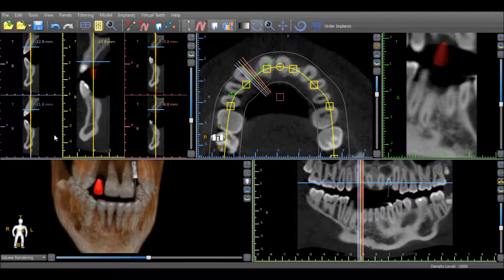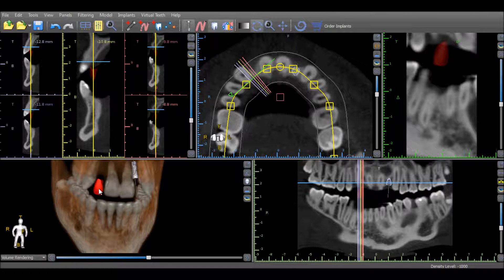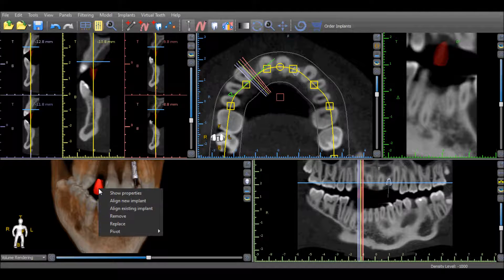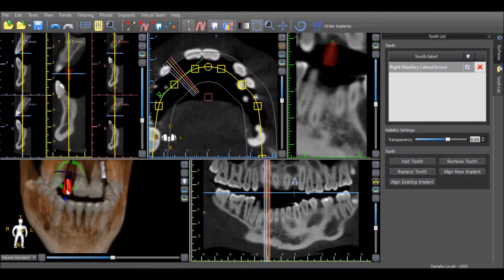Once the placement of the virtual tooth has been finalized, additional options can be accessed by right-clicking on the virtual tooth, or by double-clicking on the virtual tooth to open the tooth panel.